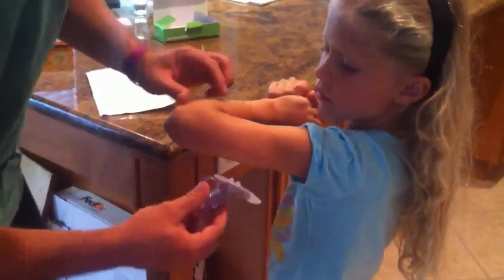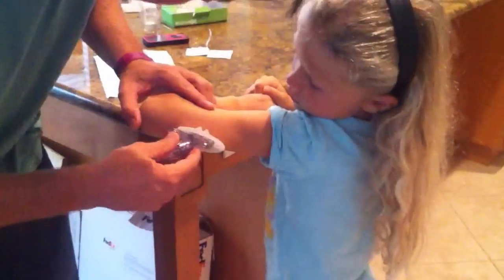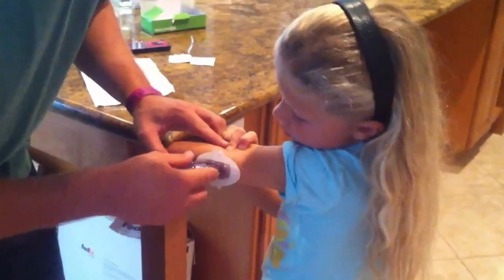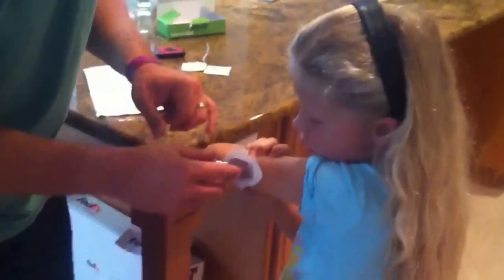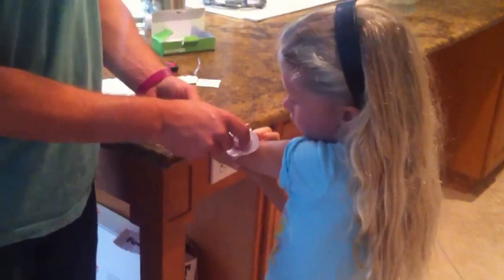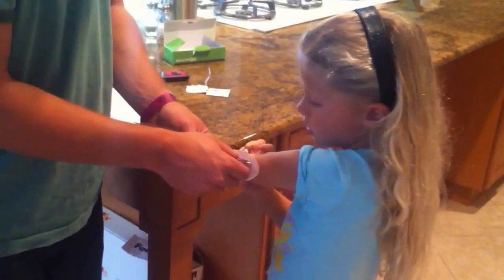We're going to put it on her arm. I'm thinking right above where... so that was the hole. I'm just going to go right above it, right there. So that's where it was yesterday — it will go right above it. That's where you want it because it will be under your shirt.